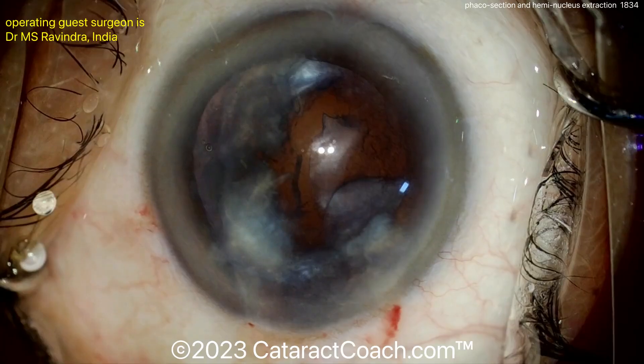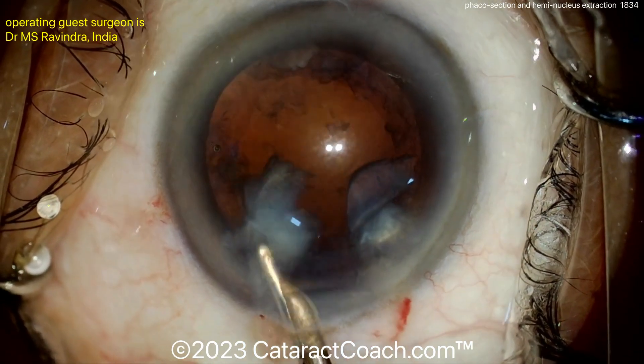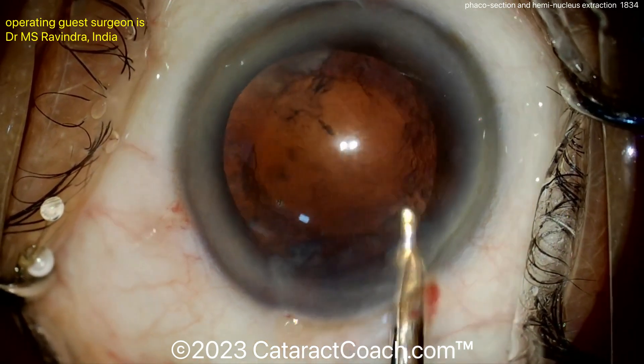SICS is fantastic too — that's small incision cataract surgery, which is a manual extraction of an entirely intact nucleus. Here using a Simcoe cannula to wash out that capsular bag and get a little bit of that cortex out.